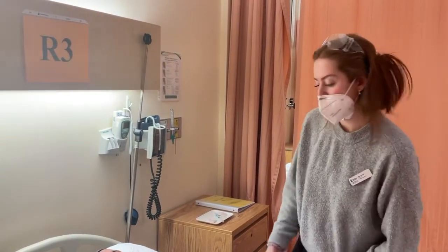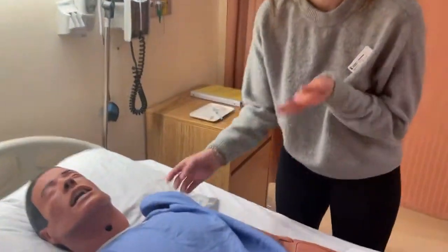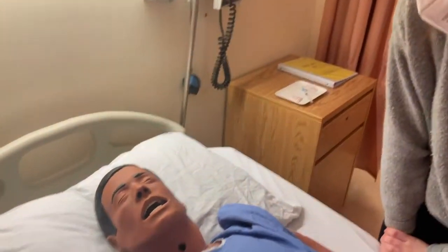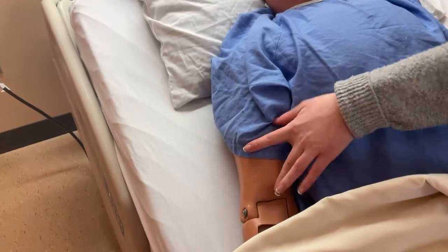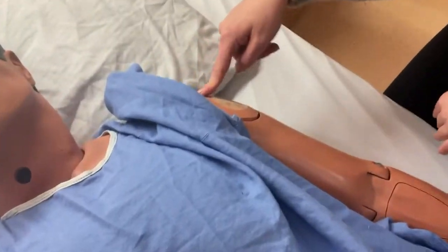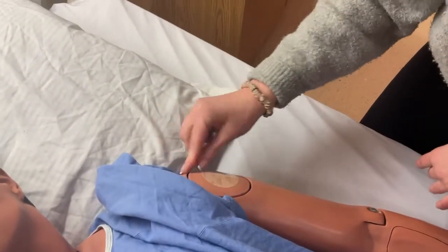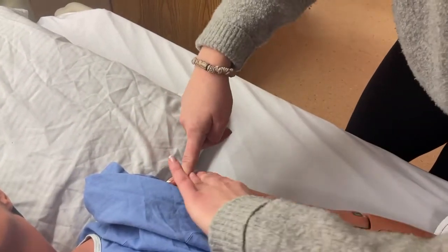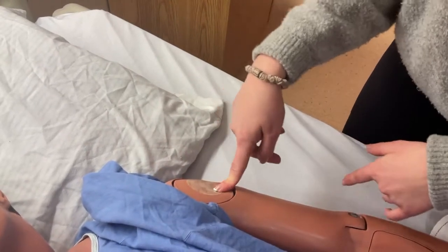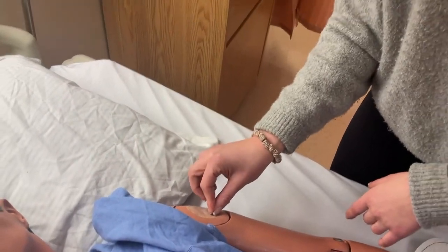He says no. Okay, so to landmark, I'm just going to look at his shoulder. I asked him, when was your last medication and what arm was it in? He says yesterday and in his right deltoid, so I will be performing in the left. So I will find the acromion process, which is just right here. I can feel it. I go about 2 to 3 fingers down, and I will find right in the middle of the deltoid a mark.